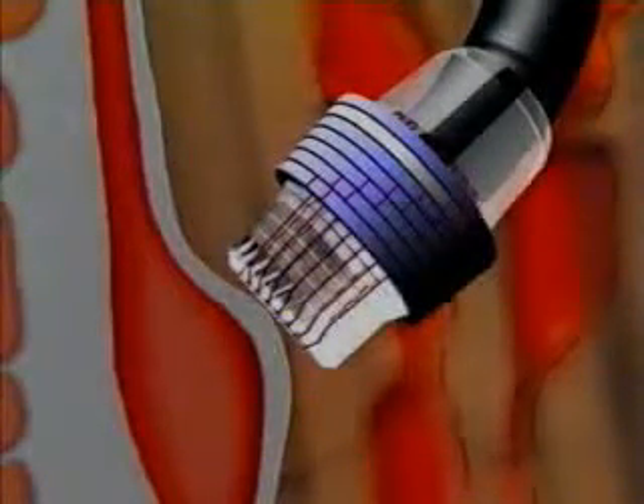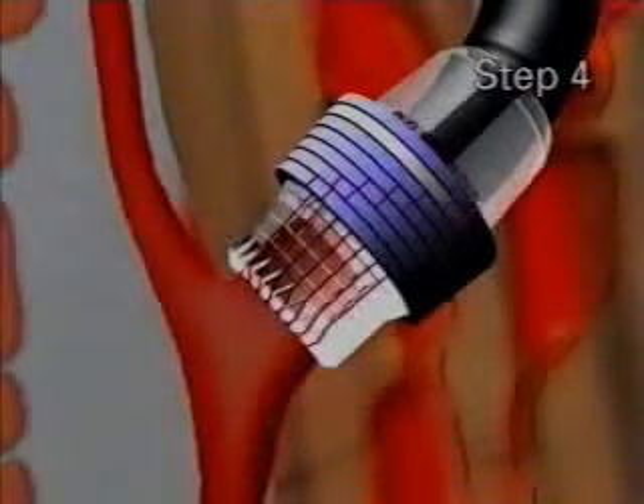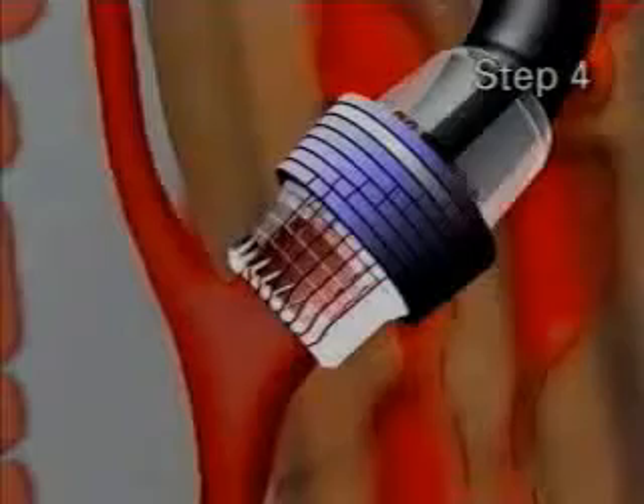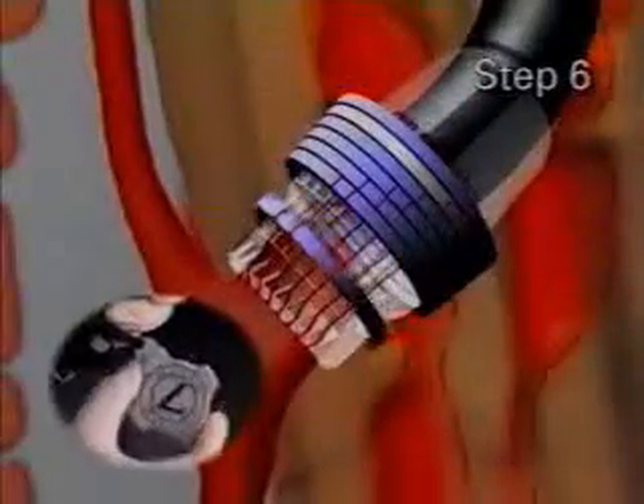Once complete contact is made around the varix, the suction of the endoscope is activated, drawing the varix into the housing. When a varix is suctioned completely into the housing, a red-out may be observed.